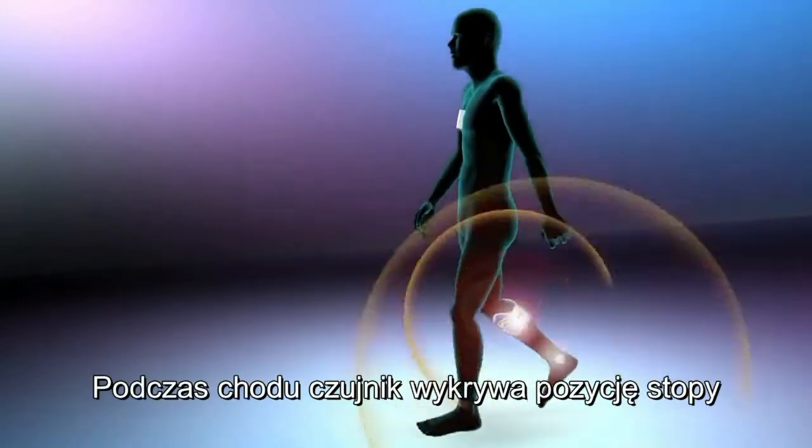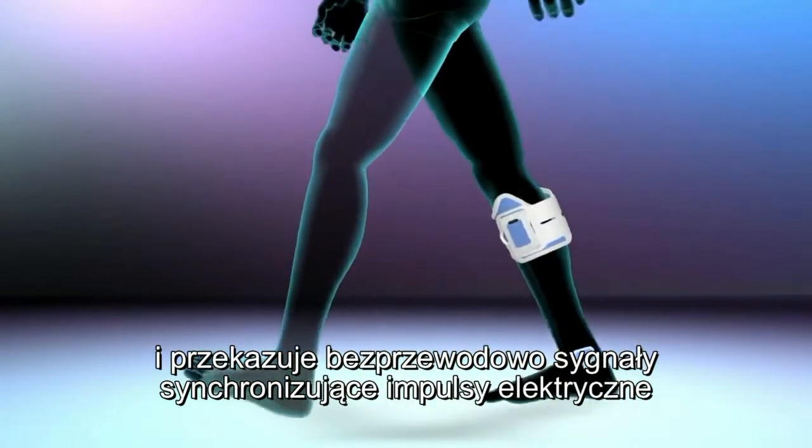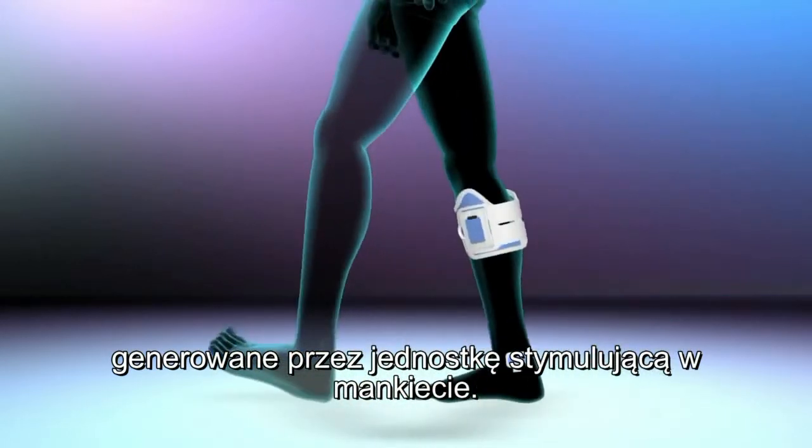While walking, the patented gait sensor detects the position of the foot and transmits wireless signals to synchronize the electrical pulses delivered by the stimulation unit on the leg cuff.